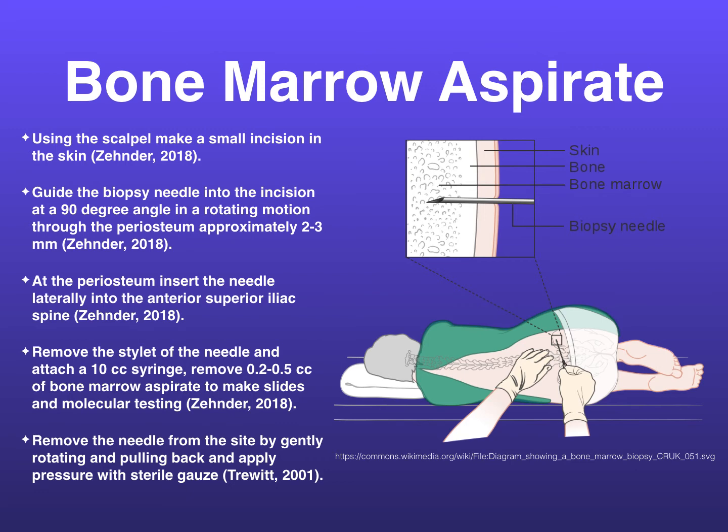Aspirate 0.2 to 0.5 cc's of bone marrow, which can also cause the patient pain, so warn them prior to aspirating. Avoid aspirating more than 0.5 cc's per syringe because it can dilute the specimen, and if the sample clots too quickly, it can't be used, and it's only a small amount that's wasted.